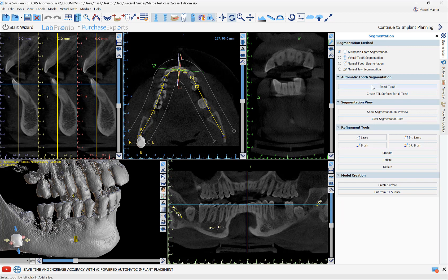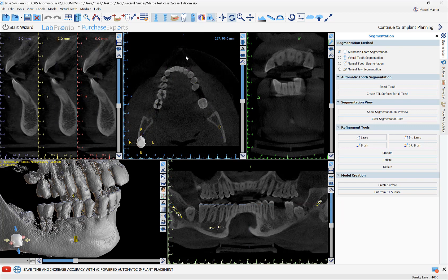We're going to click 'Select Tooth.' Before doing so, if you'd like to remove or hide the colorful line indicators, you can do so simply by clicking on the button right over here. Now we can click 'Select Tooth.'